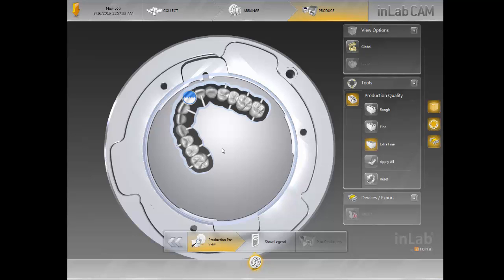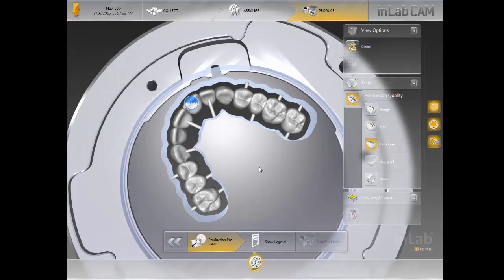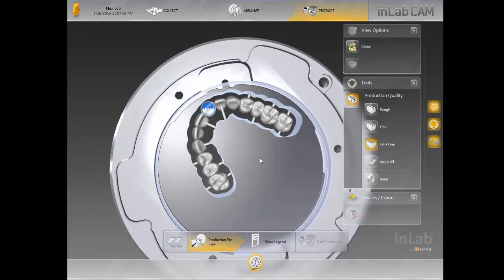That's the process when it comes to designing cases and exporting to the CAM software. Our laboratory does a lot of different wax-up cases and we can handle big cases like this. As you noticed, I designed this case in about 20 minutes — and I did go back and forth a couple of times to show you the different choices. But normally, an anterior six-unit case takes me about 15 minutes to set up and move forward.